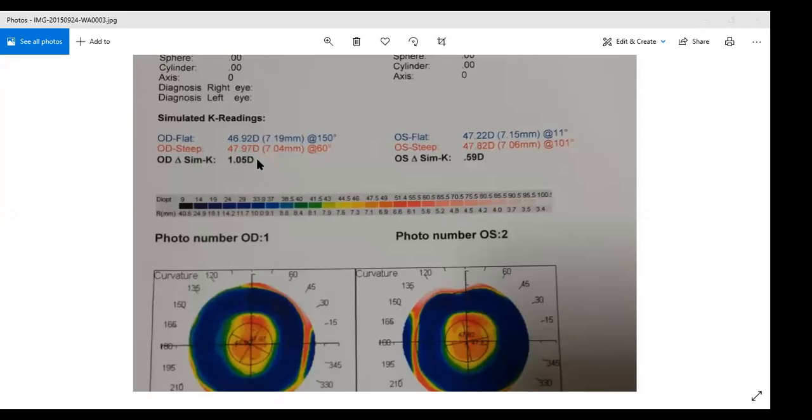Suppose if this was a keratoconus, one would have been say 42 and the other would have been 48, but these two will be very close to each other and there'll be hardly any astigmatism. And this is how the central zone of steepening looks, followed by this mid peripheral area of flattening, which is where we actually carry out the excimer laser to correct a hyperopic power.